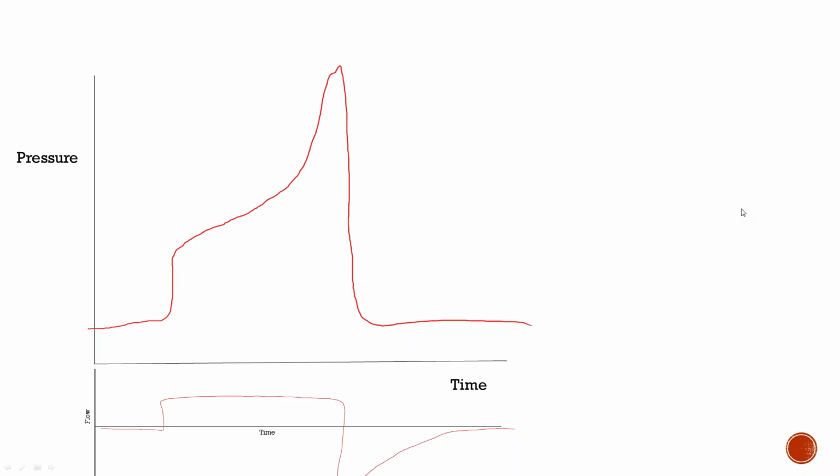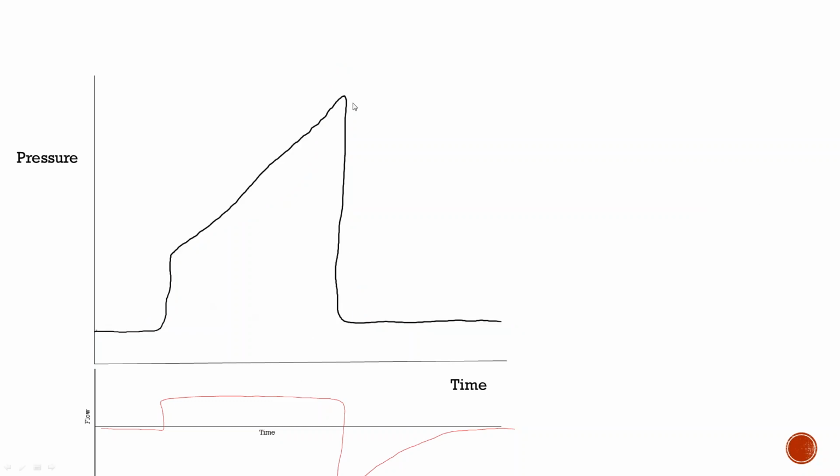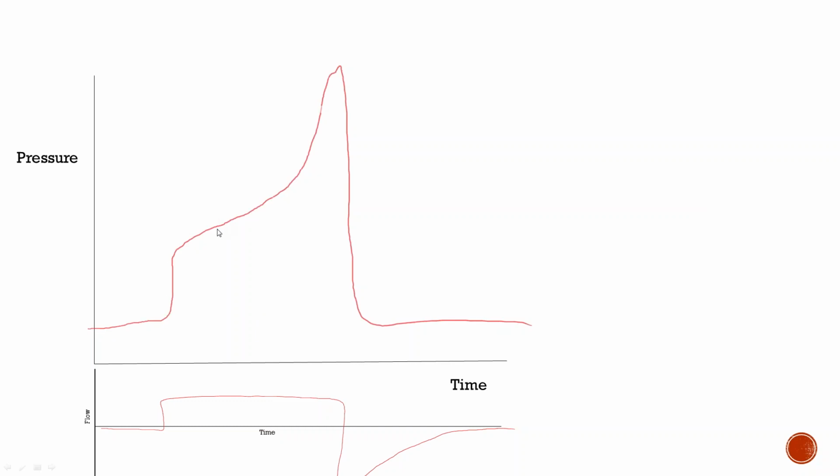So this curve is describing something called the stress index. Now, this is very specific to a volume-controlled mode of ventilation, and what you can do is, as the previous curve showed a nice straight slope, Lionel is correct to mention that this slope was what the term he used was bendy. If you draw that same line that you had before, you can see the slope is a little bigger, it's greater than what this slope was.